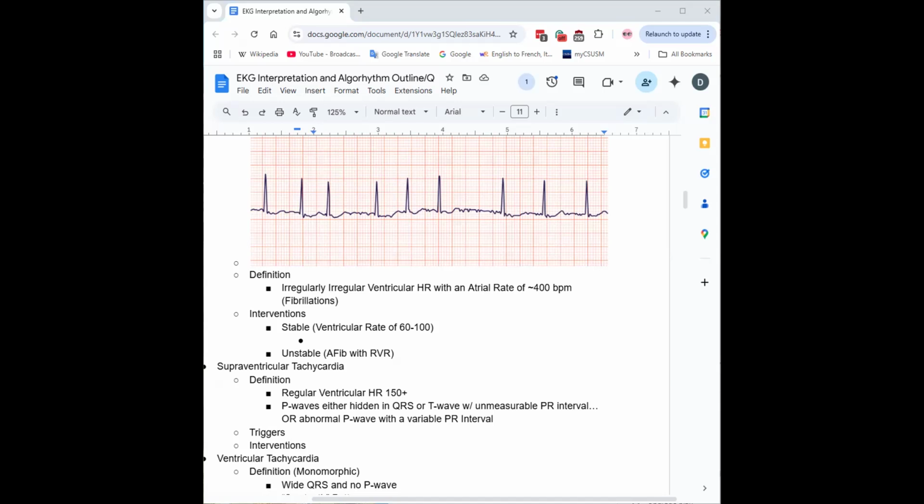I was actually about to put that question in the chat. I was writing the question as you were mentioning my name. In that case, ask it and see if people can logic it out as I start adding some information down from what we already talked about first. The question I was going to put was: if you were to do a synchronized cardioversion, what are some considerations and actions that you should be doing before?